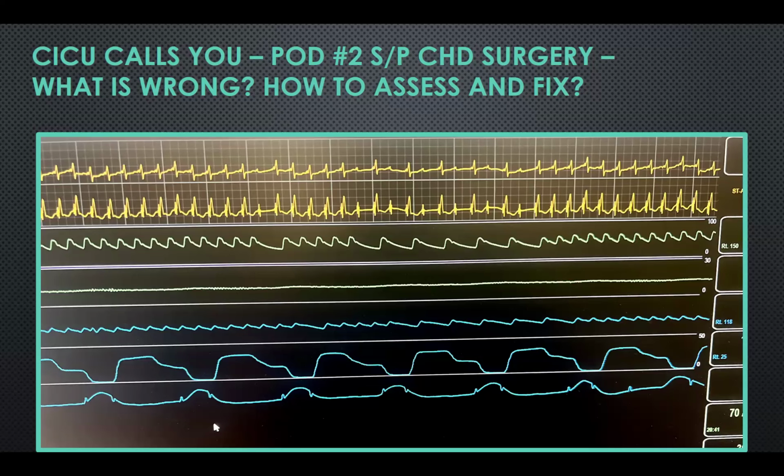But on balance, the thought is, try to make the leads softly adherent enough that they do come out. But if they break off, which does happen, I think it happens here maybe once a year, it's not really a big deal. We just usually leave them behind.